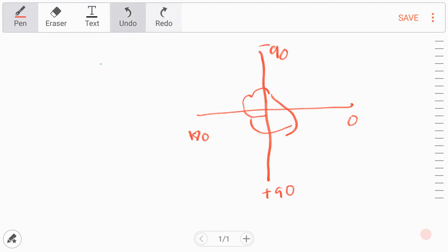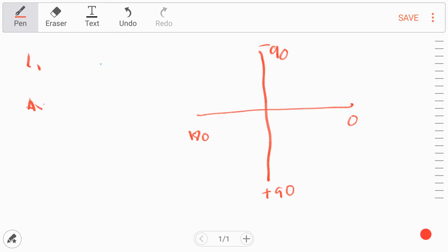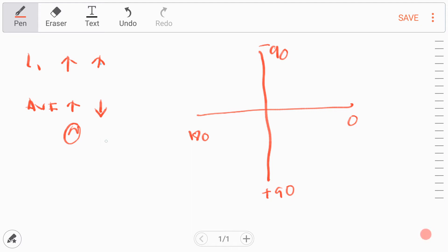To calculate the axis on an ECG, look at Lead I and AVF. What you need to do is look for the R waves. If the R wave in Lead I is positive and the R wave in AVF is also positive, then it's a normal axis. If the R wave in Lead I is positive but in AVF it is negative, then it's going to be left axis deviation.